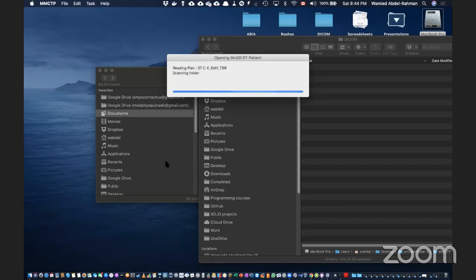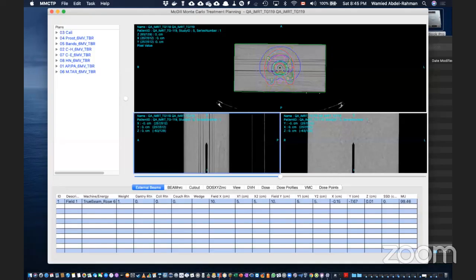There is another question, whether you can create a treatment plan using this program. That was one of the questions: can you do a VMAT plan using this? VMAT is inverse planning. You see, there are things that people are confusing. IMRT and VMAT are inverse planning algorithms, right? EGS is not that. EGS is something where you tell it, okay, these are the particles, go and calculate the dose for me. It's not an optimization algorithm.